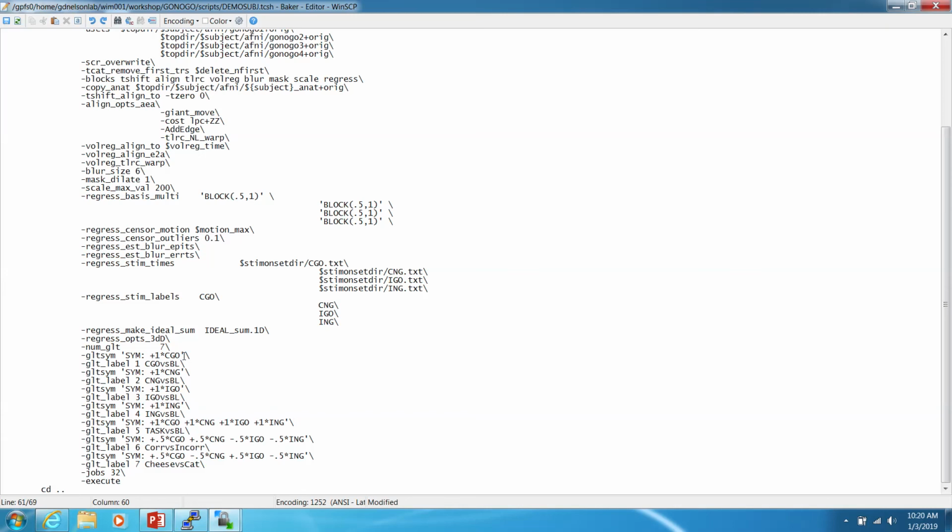Right, so basically what we're doing is, for every voxel in the brain, we ask whether the BOLD signal in this voxel is related to whatever event we're having them do. In this case, they push a button when they see a mouse. For every voxel in the brain, we say this is what the BOLD signal should look like, and it will play out over 30 seconds.